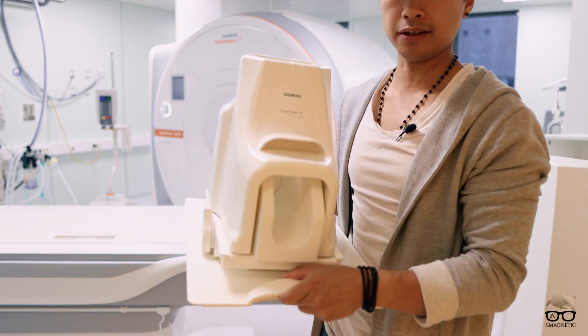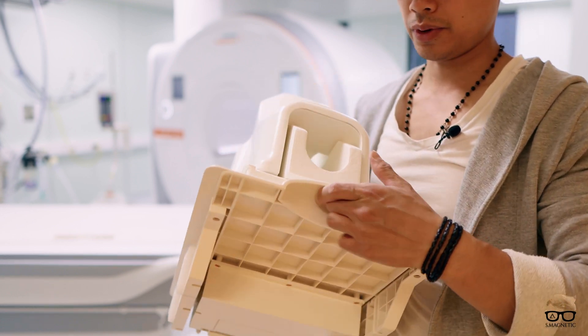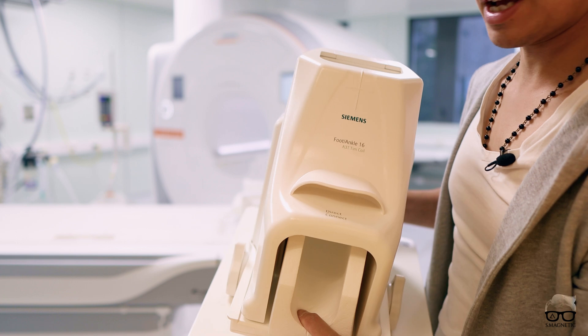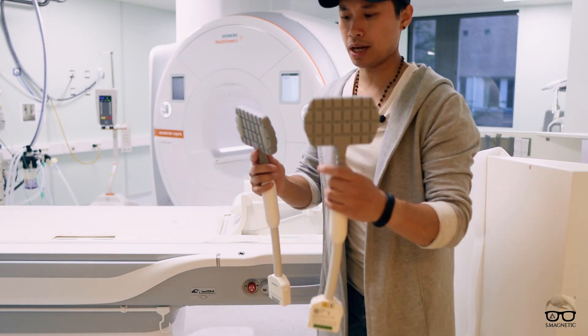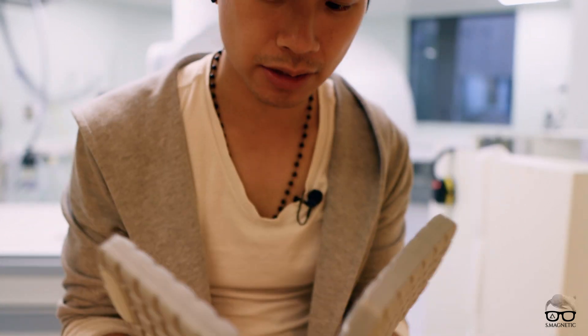Another coil we have is the foot and ankle coil. The foot and ankle is a new one for the Vida Fit — we couldn't use the old one so we had to buy a new one. It looks similar, 16 channels.